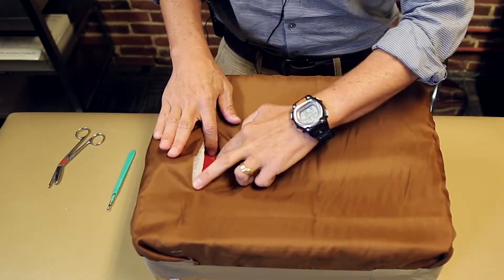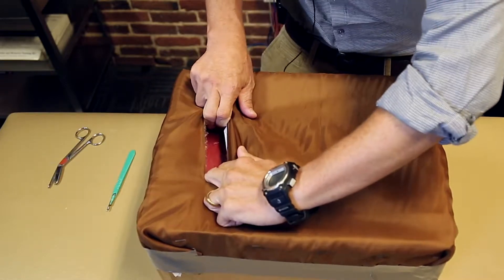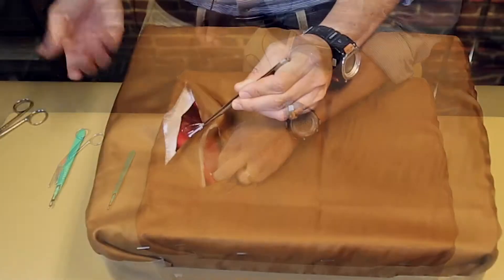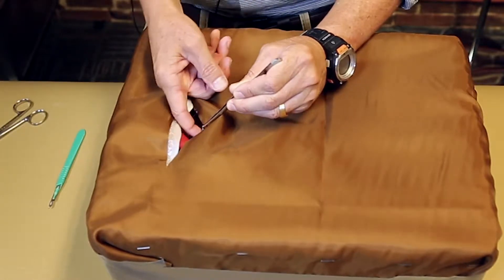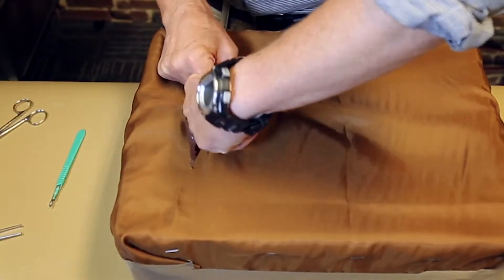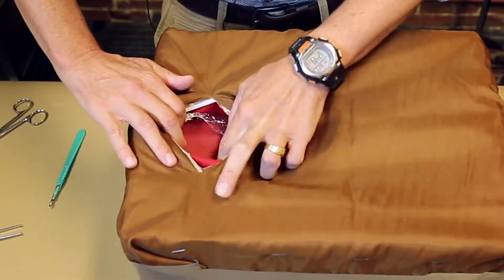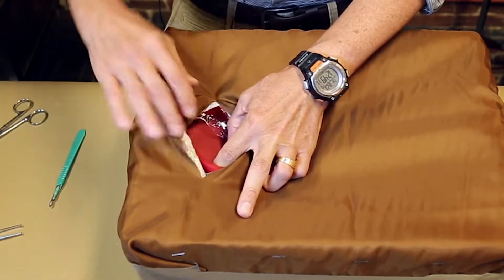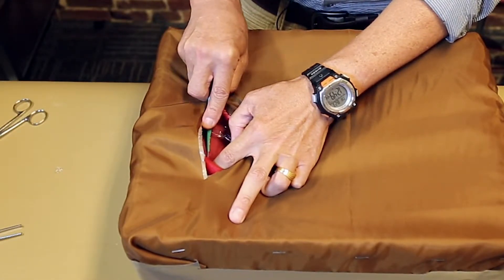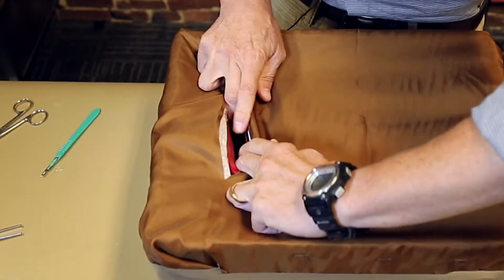Now we're at the level of the rectus muscle — you can see the red felt. Divide that with blunt dissection, opening for exposure. Now we're down to the level of the peritoneum. With the peritoneum, you can just bluntly enter just as you would normally, then bluntly open the peritoneum. Now you can use your retractor — you can see your uterine layer. We do the sharp incision into the uterus and we're inside, then do the blunt opening of the uterus.